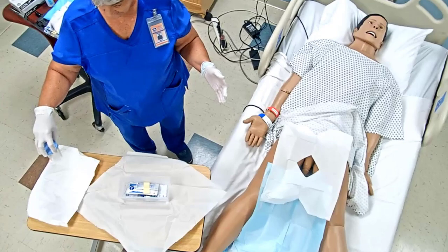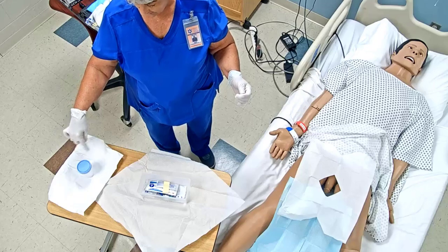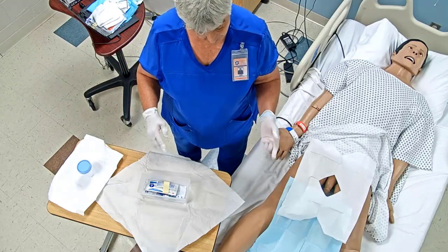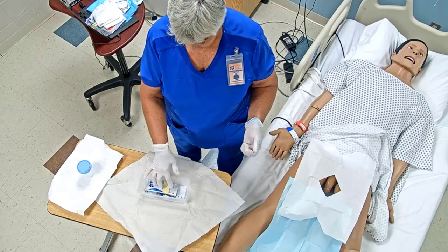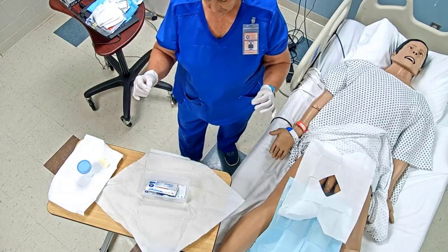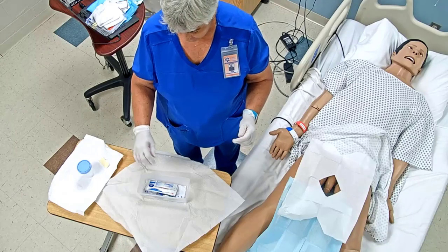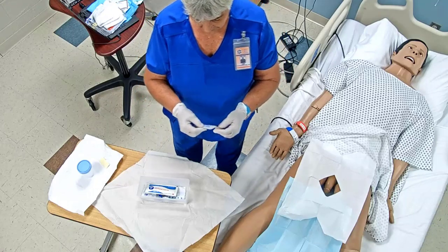Now make sure you have your hands up here high so that when you put it down, there's no way your gloves come in contact with the package, okay? And so I'm going to come back over here. Now, when I get ready to do my procedure, I can turn my back because the lid is on the cup, okay? And the inside's what we need. So this is my label. Now, I will have the requisition that has the label and everything with it from the computer, has a patient's name and date of birth and information about it. Okay, so remember I turned that so I don't have to worry about reaching in over here.